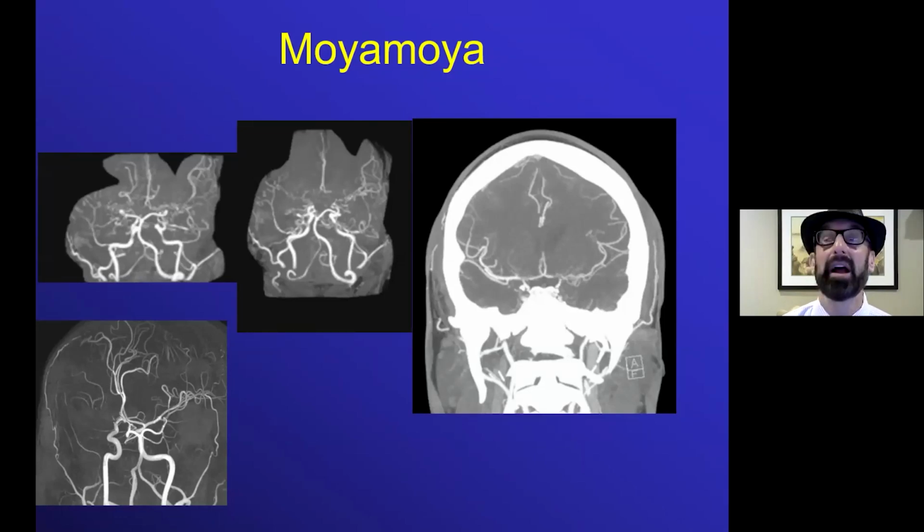When we see a single carotid artery with a puff of smoke that's secondary to sickle cell disease or to radiation vasculopathy or to severe atherosclerosis, that term should be moya-moya syndrome or moya-moya appearance. But the disease, as it is described, should be bilateral involvement and generally of an idiopathic cause and more common in the Asian population.